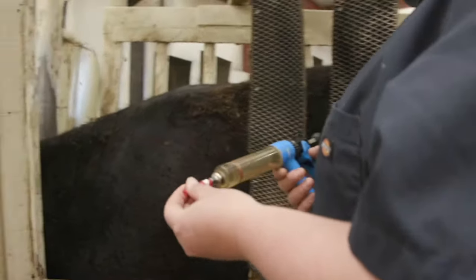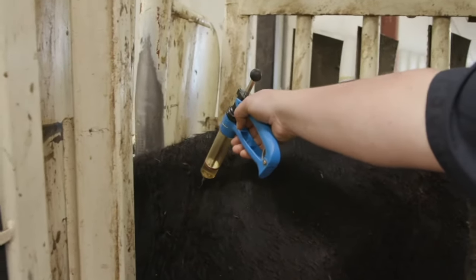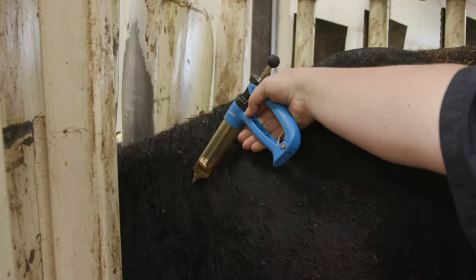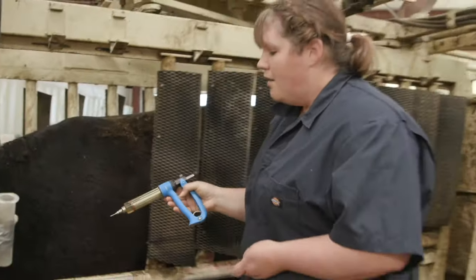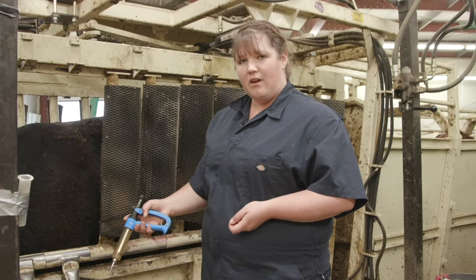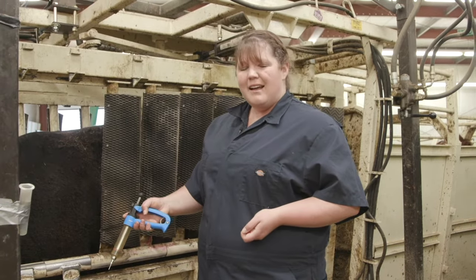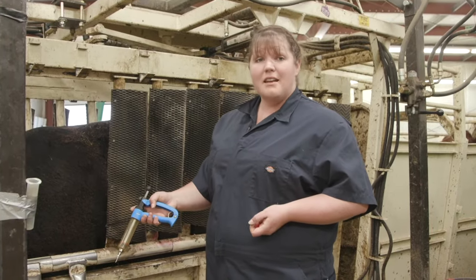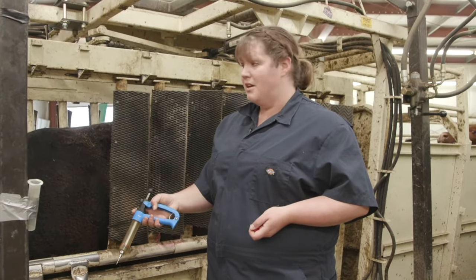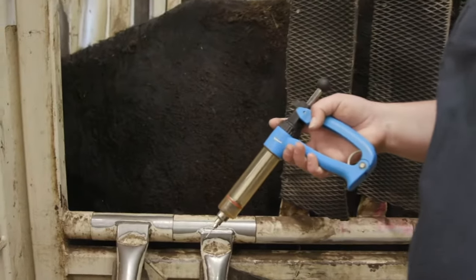When we go to give a sub-Q injection, you can use a one-handed technique. Take your cap off, come into your injection site at a 45-degree angle, pop in, pull, release, and pull out. Where things can become problematic is if when you apply the trigger and squeeze to release your drug, it feels stiff and sticky and not going in easily — you're probably not fully through the skin and into the subcutaneous space. The subcutaneous space is under the skin but above the muscle and should be a nice, easy administration. If there's any resistance, you may need to pull back out, try again, and make sure you go deep enough to get through the skin altogether.